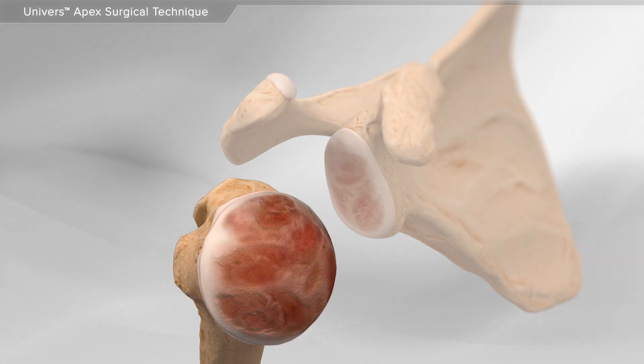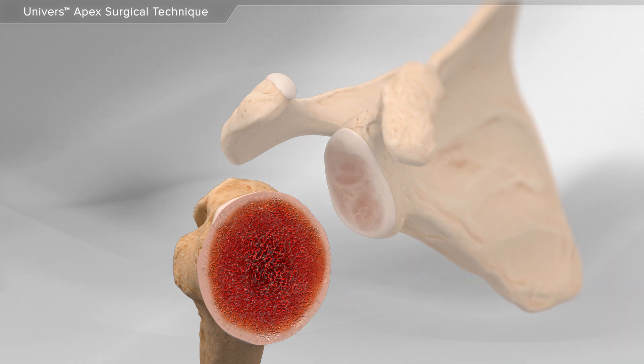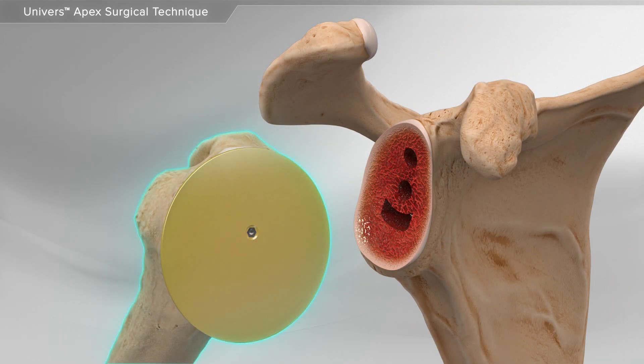First, your surgeon removes the damaged parts of the bone and prepares the two bones for the implants, starting with the humerus and followed by the glenoid.